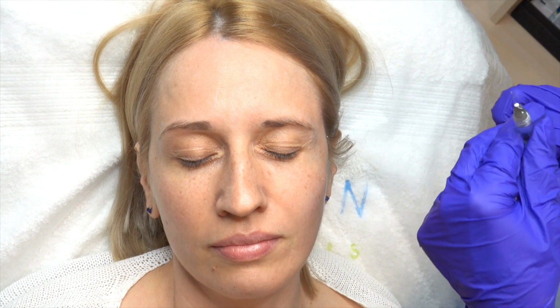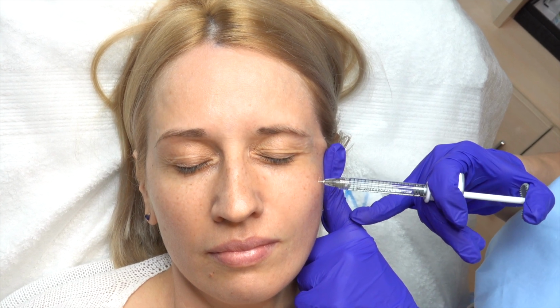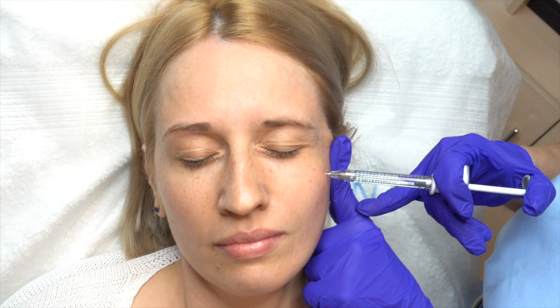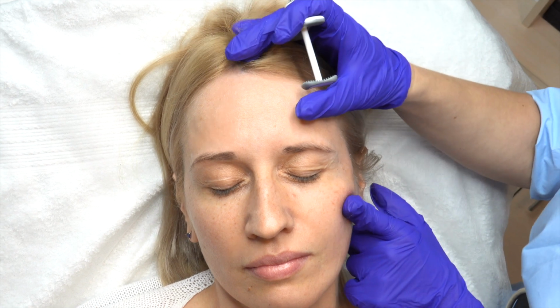Done. 0.1, then again here 0.1, and this beautiful definition I split in 3 points, 0.1, 0.1 and 0.1, and you can see that we already have this definition. Great.